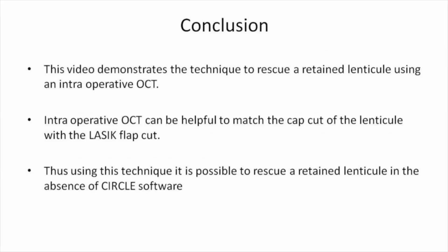This video demonstrates the technique to rescue a retained lenticule using intraoperative OCT. Intraoperative OCT can be helpful to match the cap cut of the lenticule with the LASIK flap cut. Thus, using this technique, it is possible to rescue a retained lenticule in the absence of CIRCLE software.